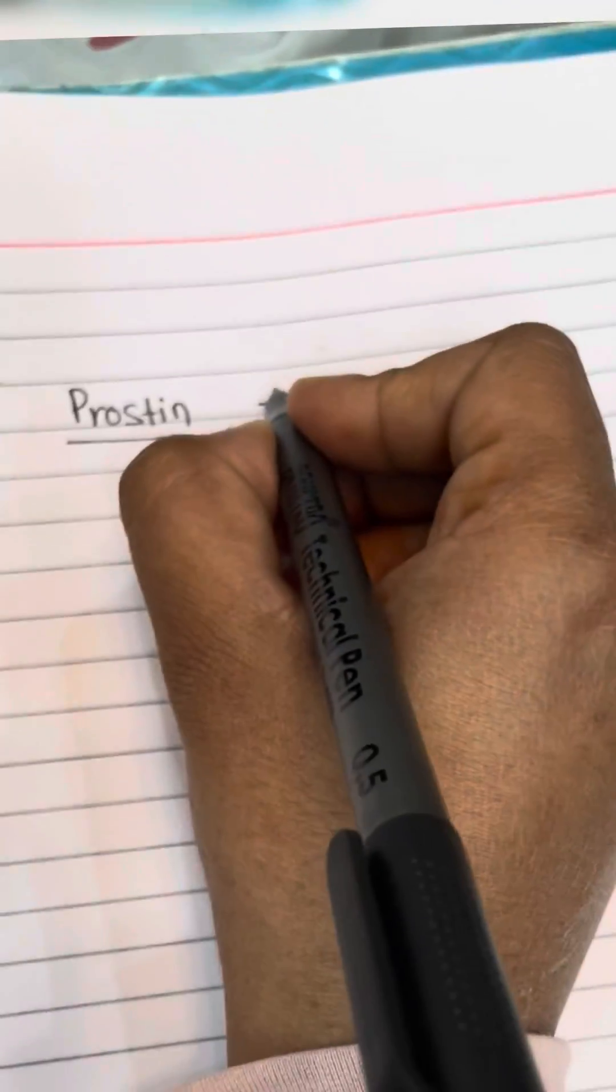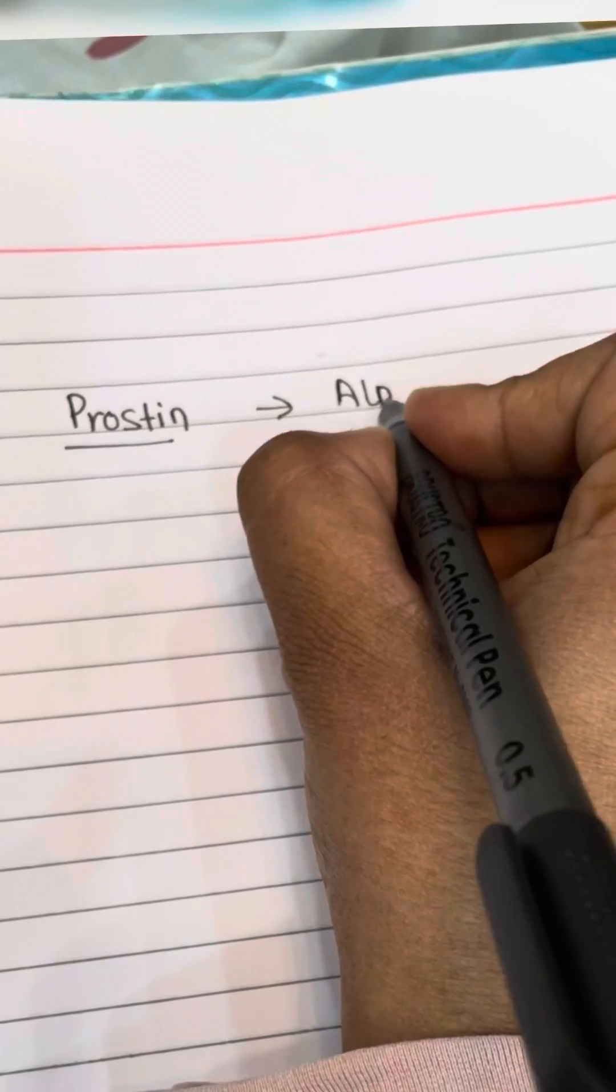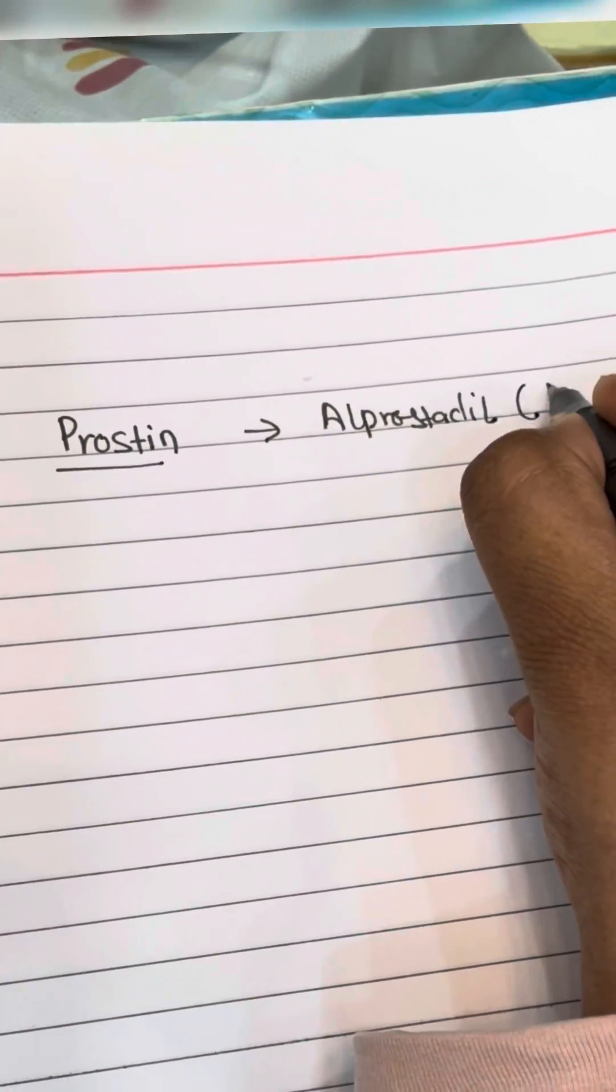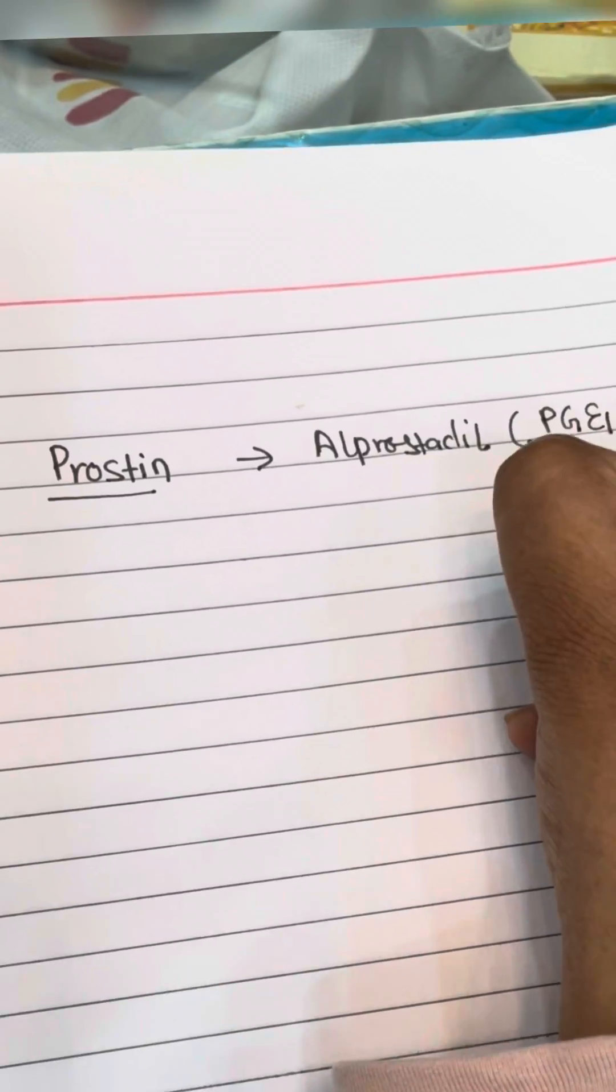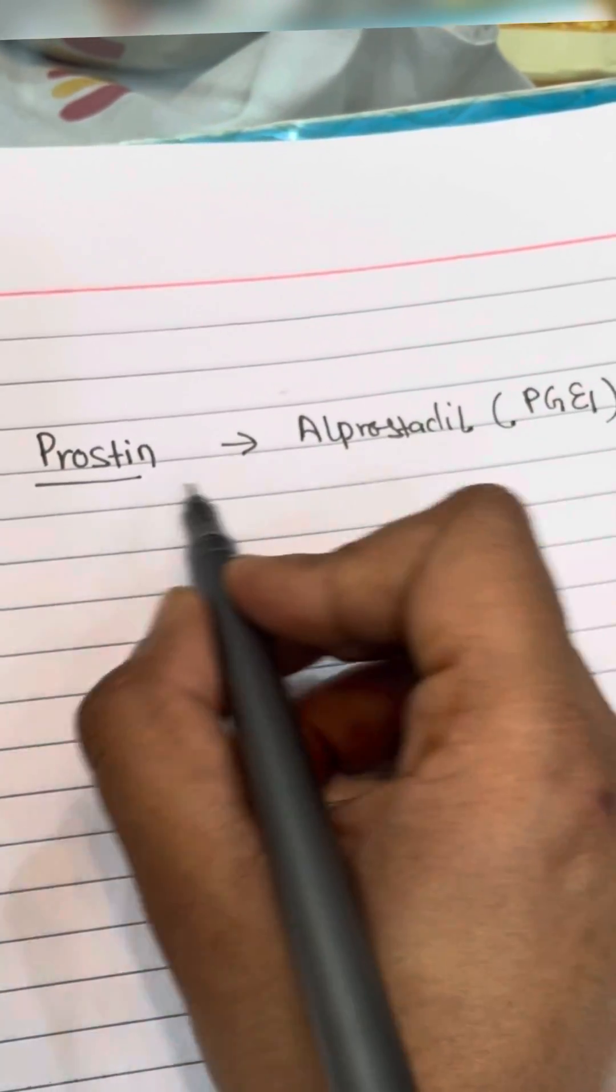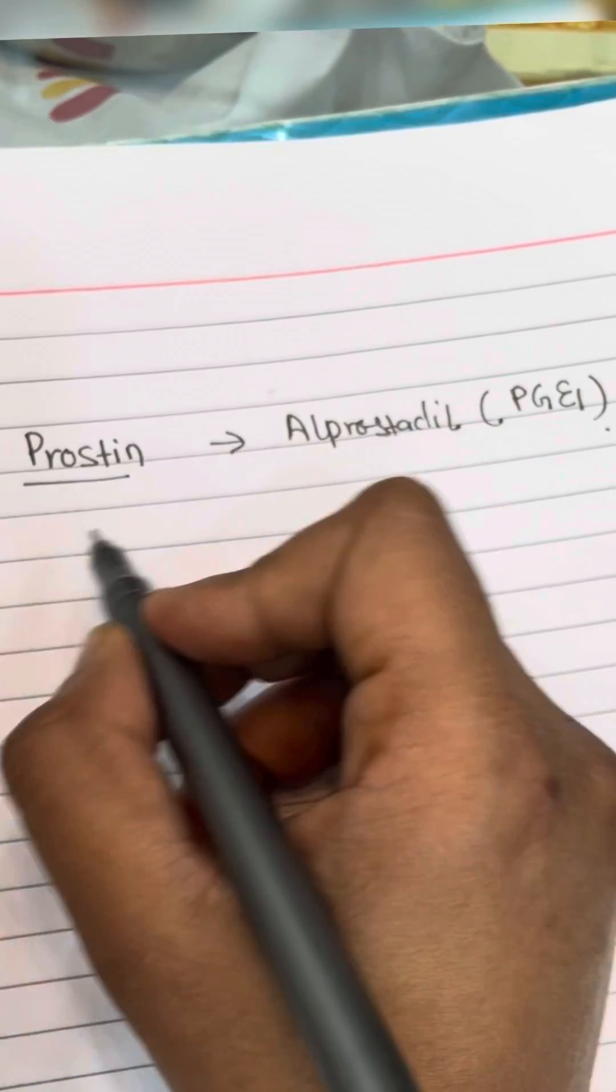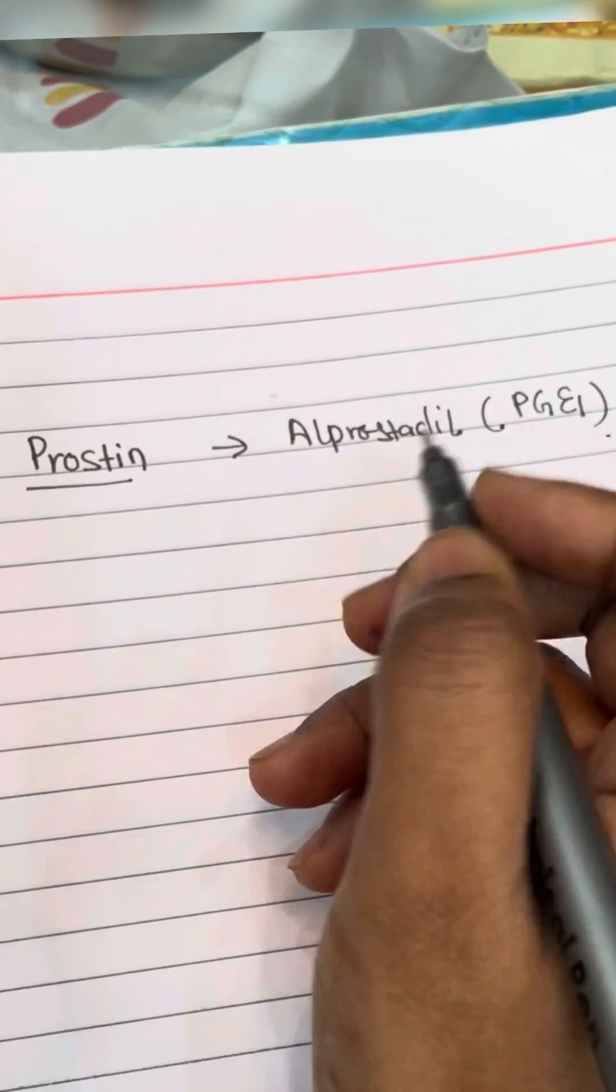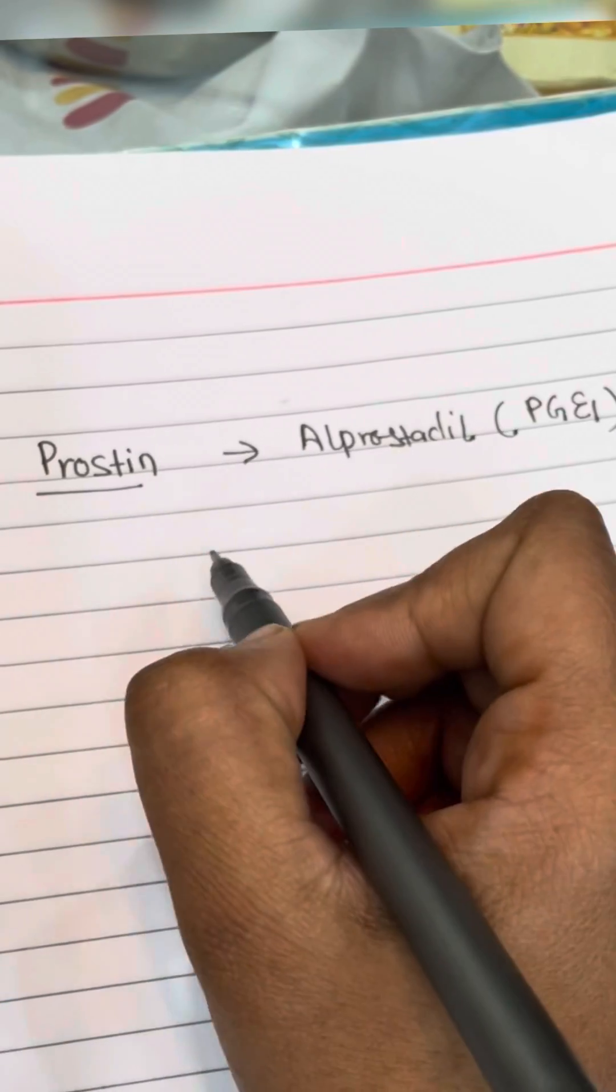Hi guys, today we will be learning how to make prostin infusion. Prostin, as we all know, is the brand name for alprostadil, which is prostaglandin E1. It is used for keeping the ductus arteriosus patent in babies with congenital heart disease or congenital anomalies wherein we want the duct to be patent.